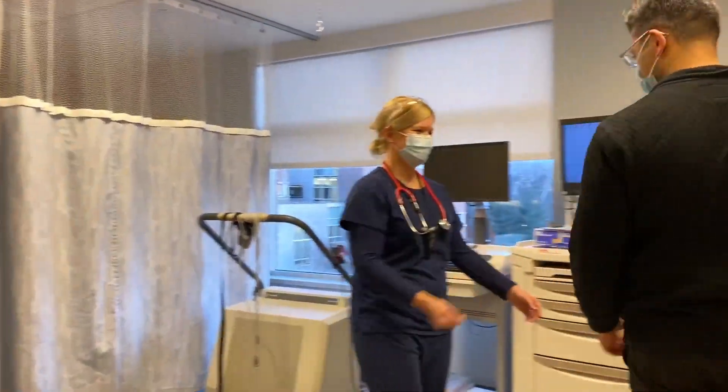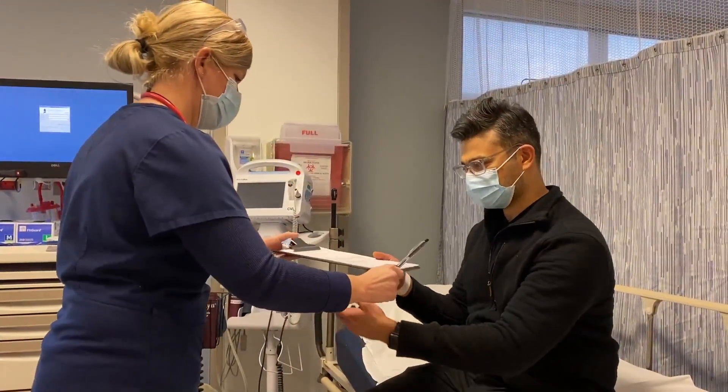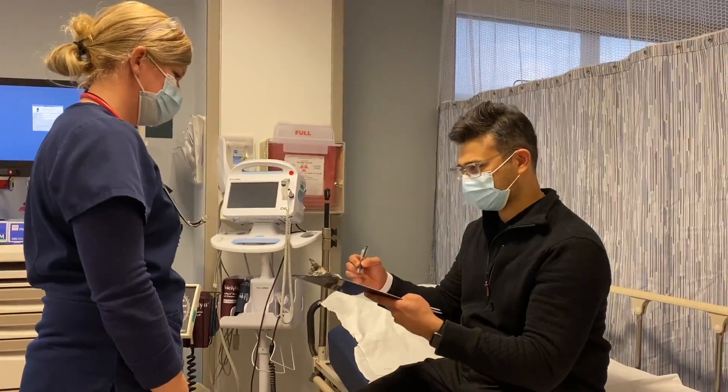When you first arrive at the stress lab, a nurse will be there to check you in. Once you are checked in, the nurse will explain briefly what kind of stress test you will be receiving, the risks and benefits of the procedure.